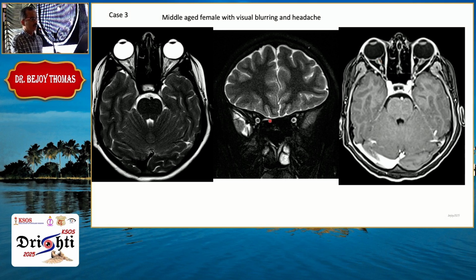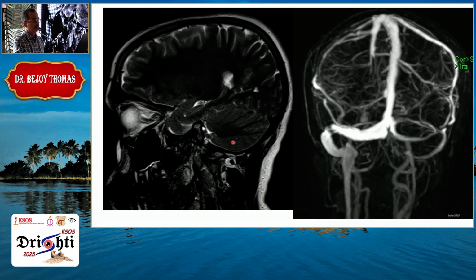So this is the optic nerve on the horizontal section. If you cut from superior to inferior, the equivalent of an AP section, what we call a coronal section, you can see there is significant perioptic nerve CSF fluid there, and it is prominent. We will discuss the dimensions later. And you have to carefully look at the sagittal images. You can see in addition to the horizontal buckling, there is also a vertical buckling.